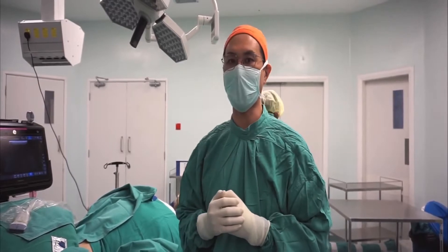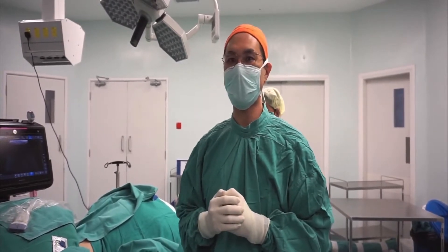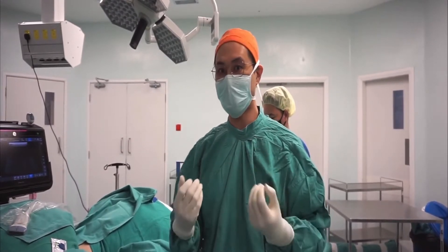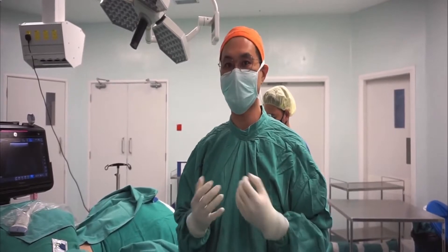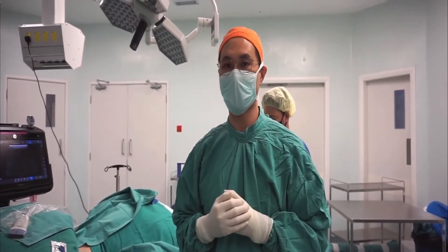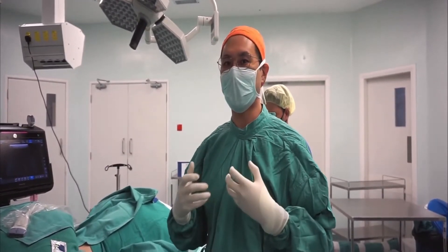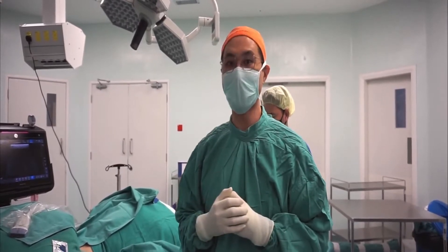The Erector Spinae Plane Block is a relatively easier and safer block compared to the paravertebral block and the thoracic epidural block. So it is a potentially good and easy block to be performed for abdominal surgery.